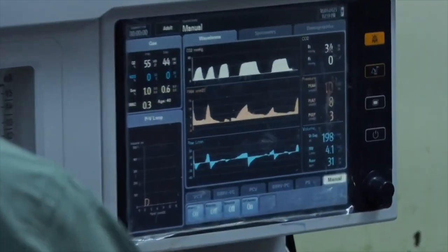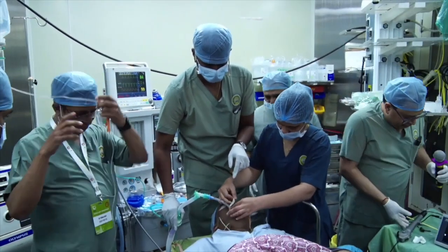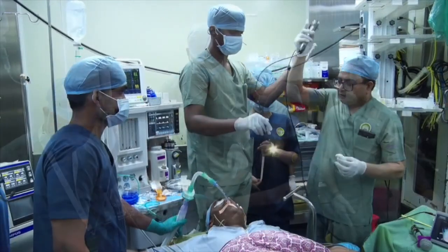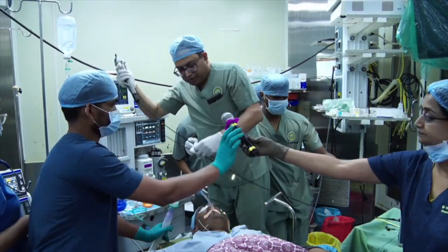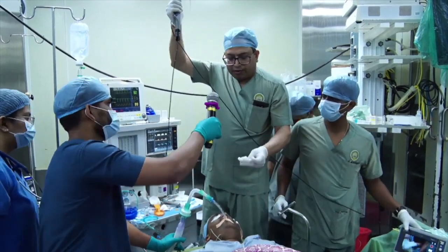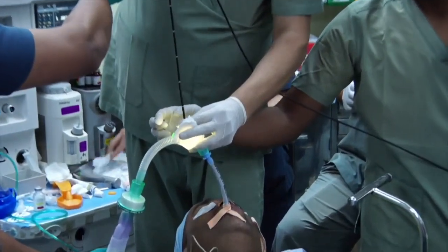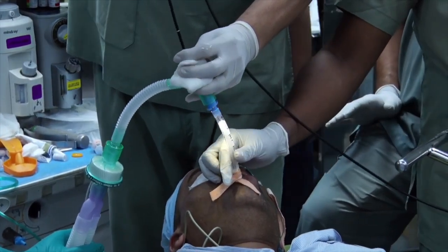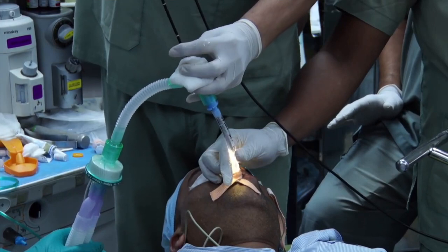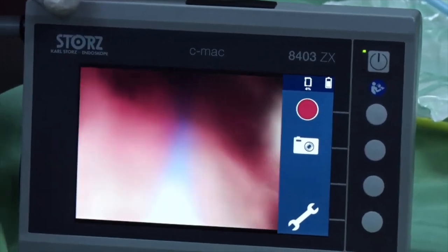CO2 is there — excellent. Once you've got the tube, tape it, then we'll show confirmation by putting the scope again. When I do a scope, my right hand is dominant. I hold the scope with my little finger and ring finger, and use my index finger to angulate it — I can control everything.